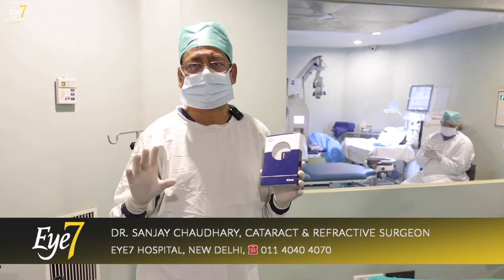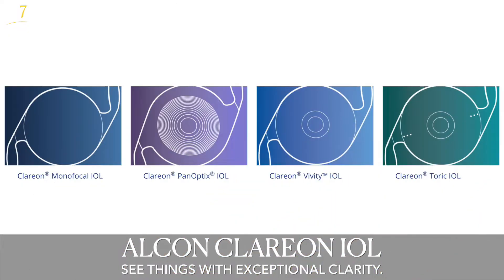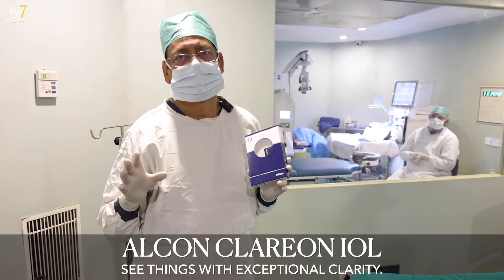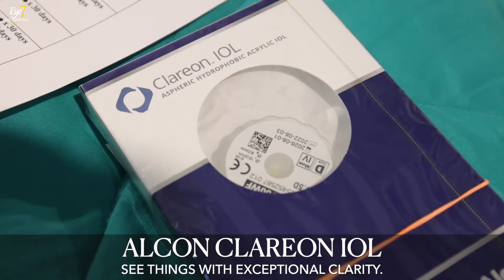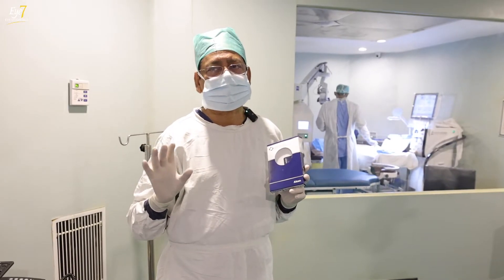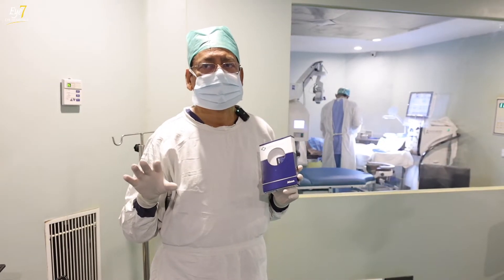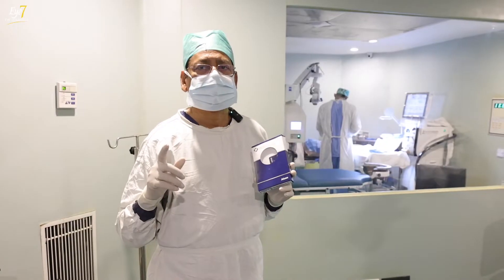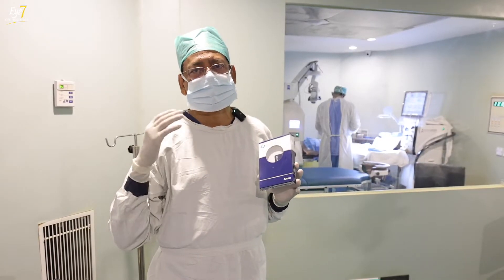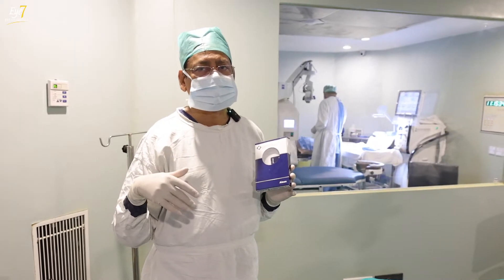We now use a newer version of the Alcon monofocal lens, which is the Clareon lens. Previously it was the AcrySof IQ platform, and now they've switched over to the Clareon platform. The advantage of the Clareon platform is that the lens is more optically clear, so there are no more instances of micro-vacuoles, which were reported in the previous AcrySof version. It is a softer lens, so insertion is smoother, and it also gives a little bit of depth perception, which was not there with the previous version.